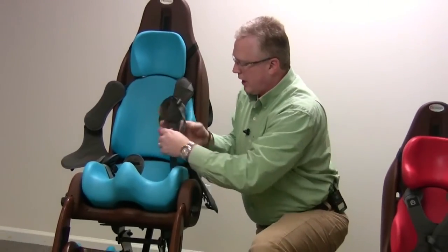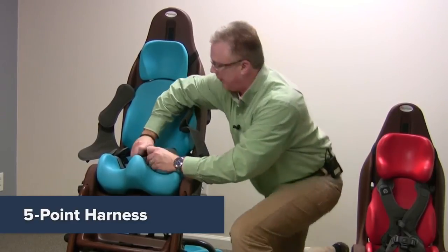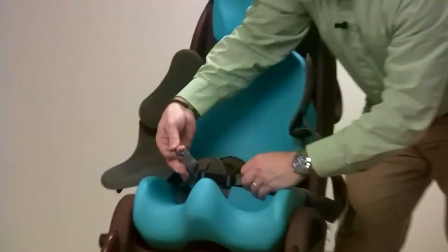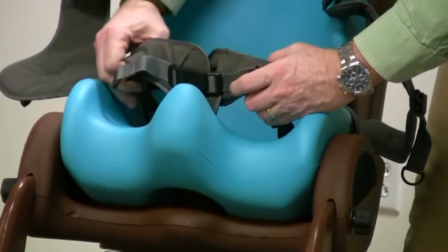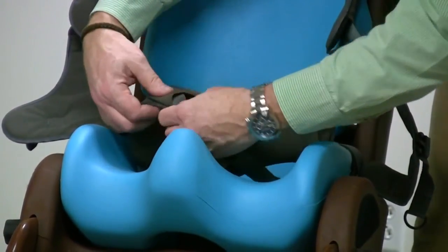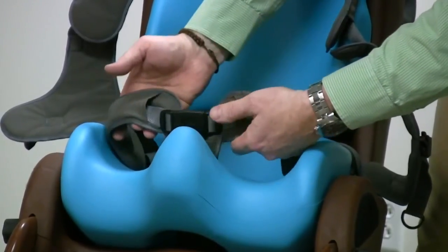The gray harness here is the five-point gray harness for the pelvic belt. Just one click in, you pull tight, and the cam locks secure the pelvis into place without coming loose. You can also take the slack and slide it right up underneath the pelvic pads right here.